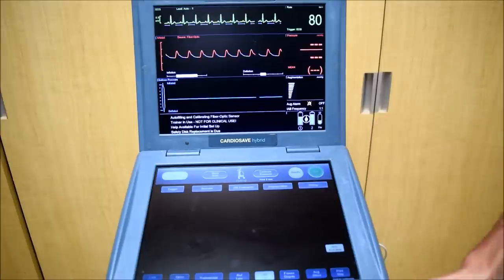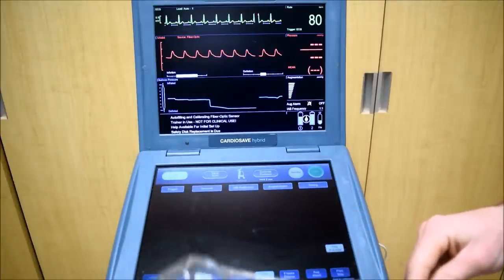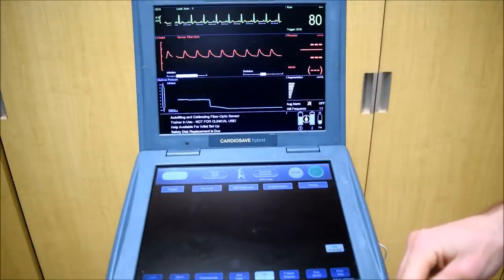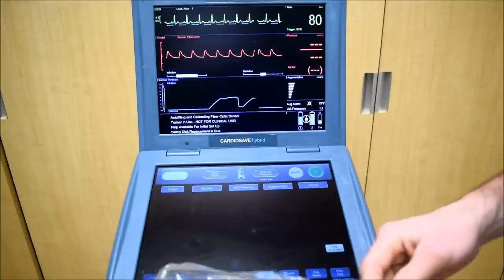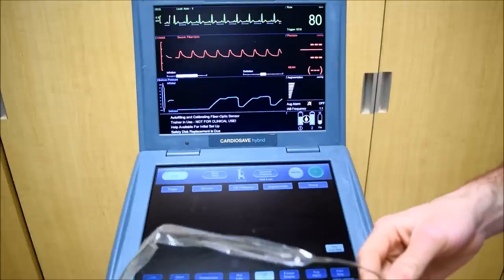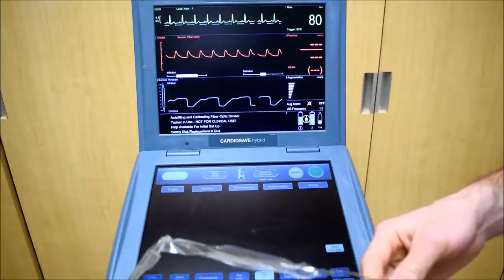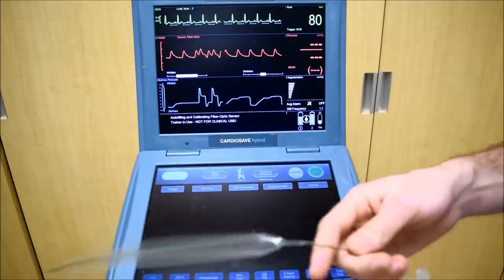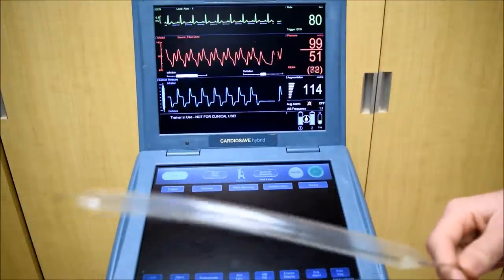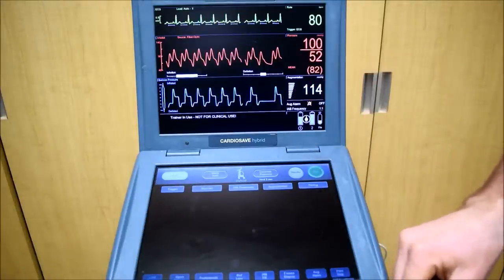I'm going to start the balloon now. When you start the balloon for the first time, the balloon has to go through its auto calibration sequence. Now that the balloon is pumping, we can see the augmentation in this lower trace.